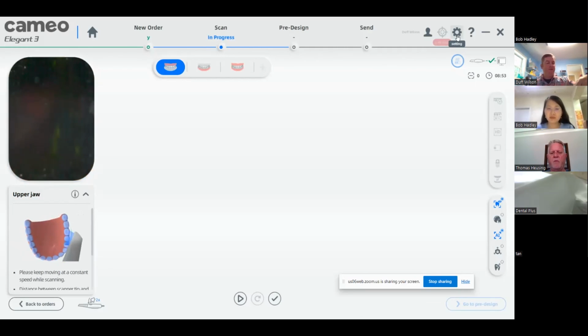All right, so here's the palate. So it's paused right now.